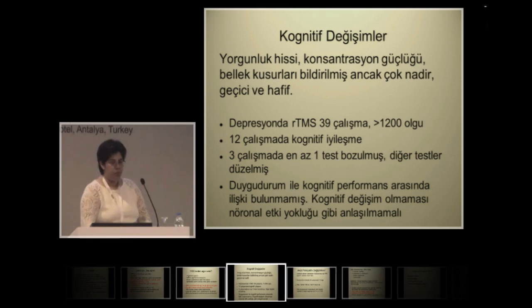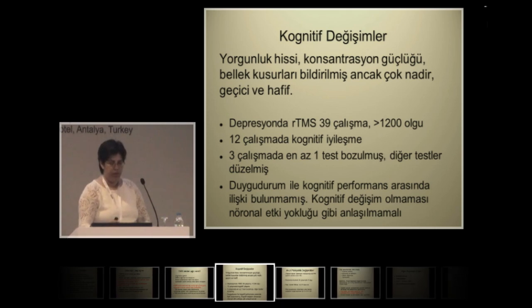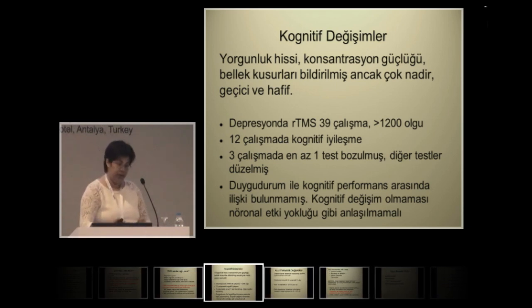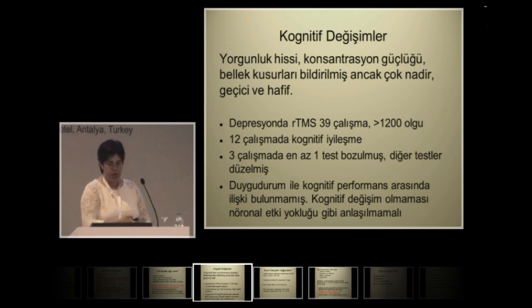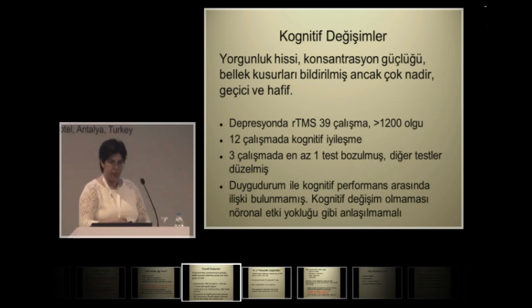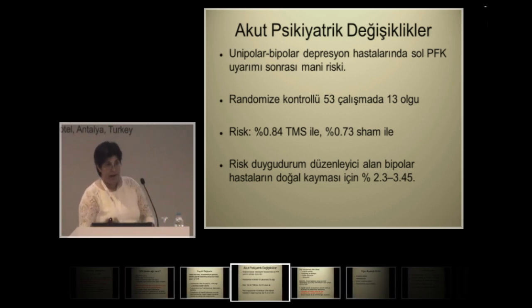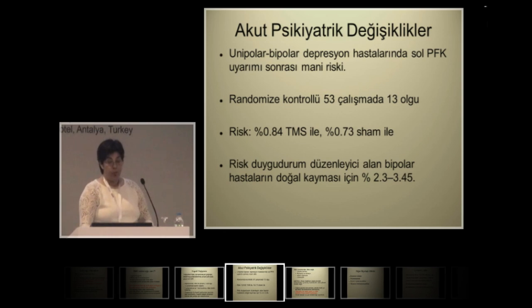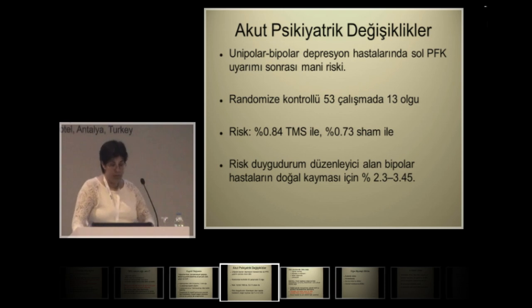Cognitive changes like a feeling of fatigue, inability to focus, and memory problems have been reported, but they are very rare. In 39 studies with more than 1,200 cases, in 12 studies, a cognitive improvement has been reported. In 3 studies, at least one test was impaired, other tests were normal. Acute psychiatric changes include, similar to other antidepressant treatments, the patient may switch to a manic state, and so far 13 cases have been reported out of 53 studies.